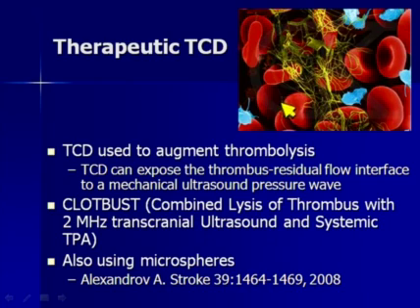We can see the red blood cells, and we can see the fibrin here. It's described to me oftentimes as the mechanical pressure wave from the ultrasound. It's kind of like a breeze blowing through a curtain, and this fibrin web is like the curtain. The mechanical pressure from the TCD is sort of like blowing this fibrin web around and around, and as such, it's exposing more of this material to the thrombolytic agent, and people see things resolve a lot more quickly. And I would suggest checking out any of these publications to get further information, but it's a great therapeutic application of TCD.